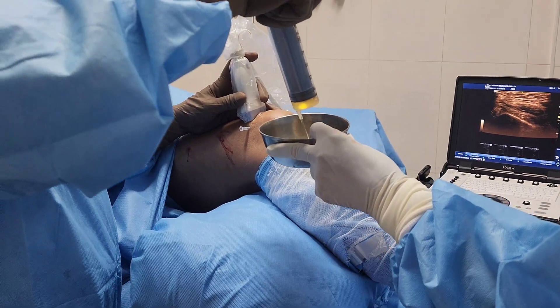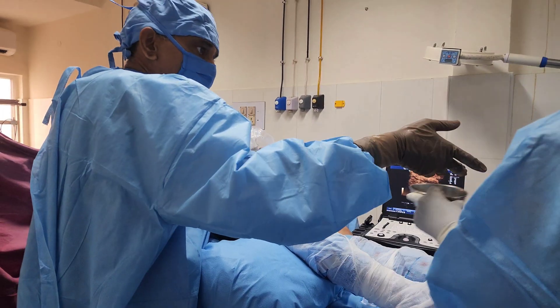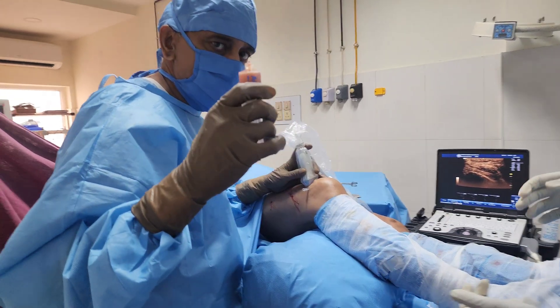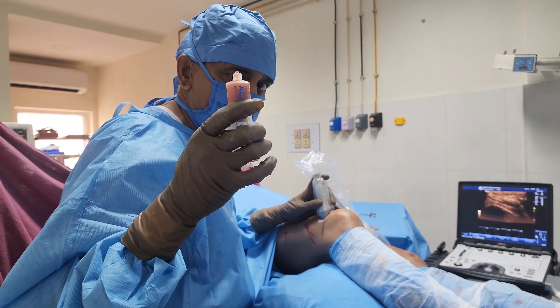Fluid has been aspirated. The needle is there inside the suprapatellar pouch and I am ready to inject SVF. This is SVF plus PRP. This combination is known as PRS, platelet rich stroma.